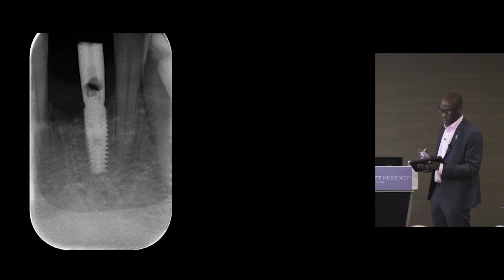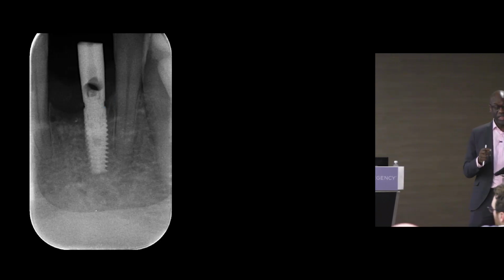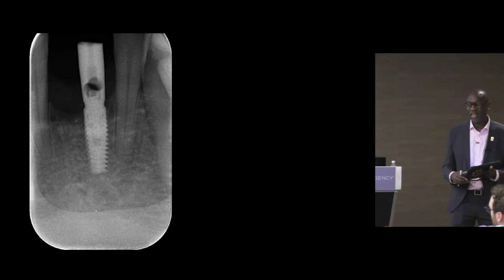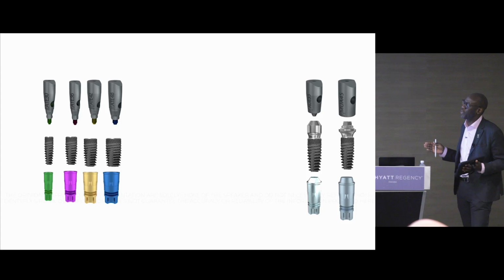Now, I had to take one recently, and if you look closely here, you'll see that there's no gap in that area. So this is the advantage of being able to show this on an X-ray. It saves a really expensive remake for the patient, for the lab, for the clinician. That's money wasted. The other thing we'll talk about is we have a fully digital workflow.